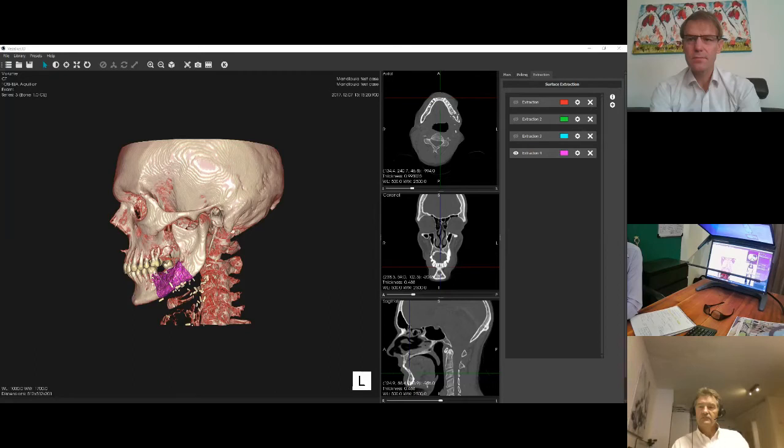As long as the scan contains volumetric data, we normally are able to use that data directly in Visualisation 3D. There are always different kinds of models that are not yet available to us.